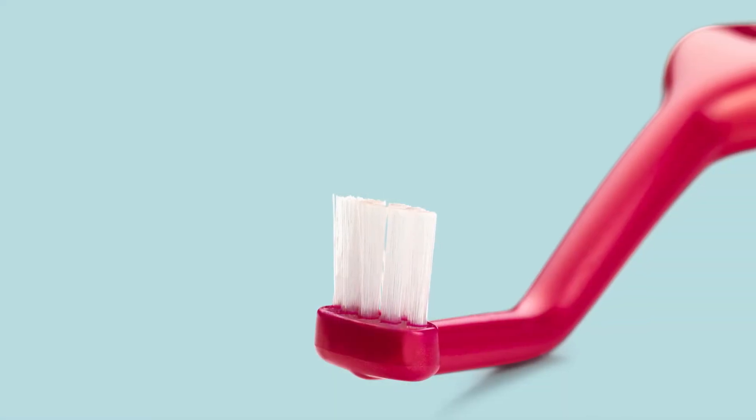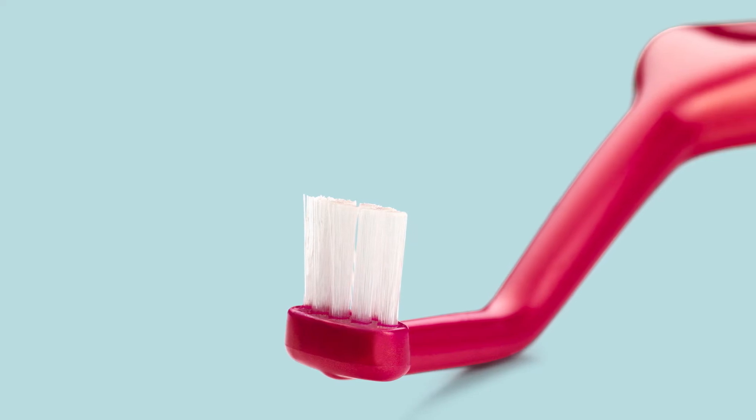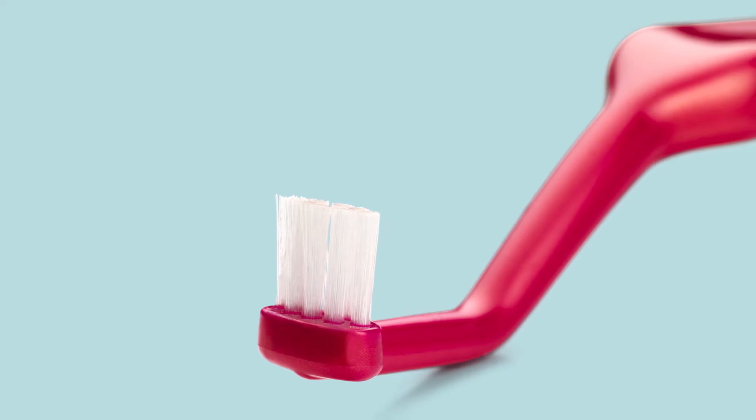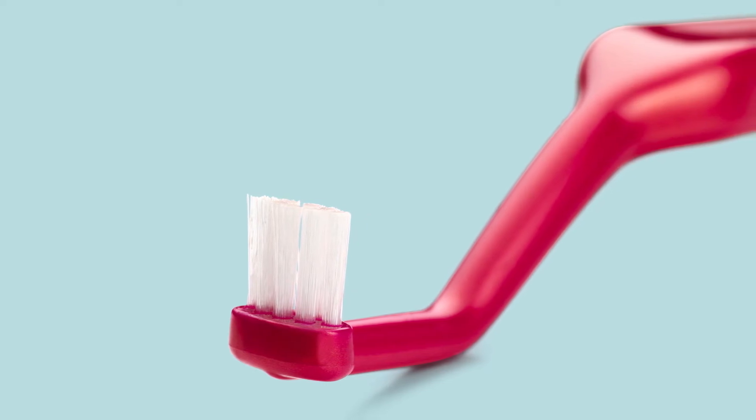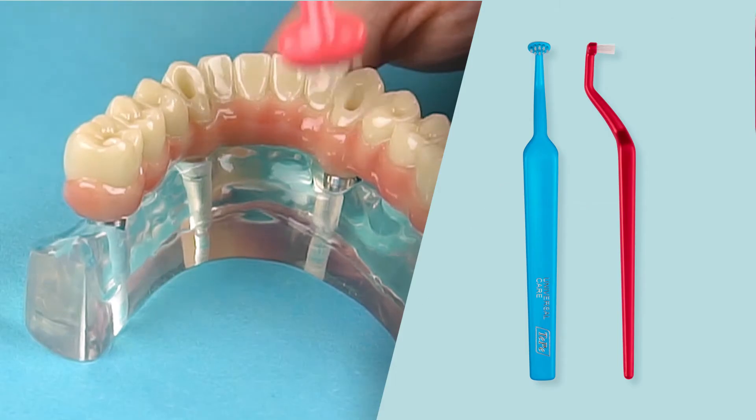The Tepe Universal Care is a unique angled brush to enable easy access for hard-to-reach areas. It is optimal for retrocline teeth, lingual braces, retainers, or implants.